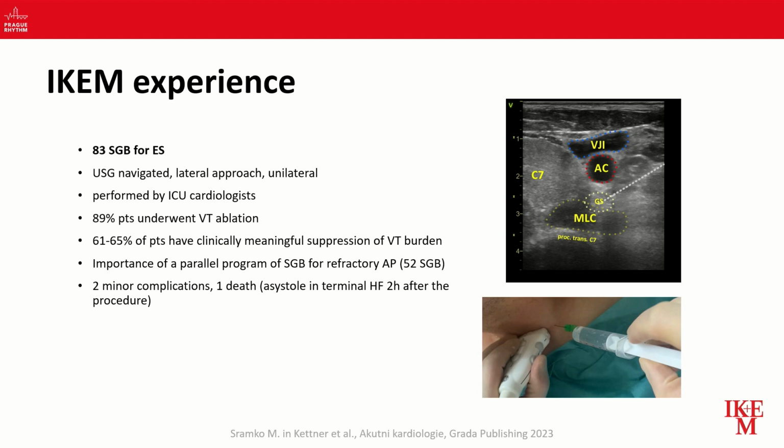So in ICAM, we have so far performed 83 stellate ganglion blockades for electric storms. And it was really a true electric storm with many episodes. We perform the procedure by ultrasound navigation. We use a lateral approach. In most patients, we use only a unilateral approach. Only in a few patients with a failed procedure and continuous VT arrhythmias, we perform also bilateral. It is in our center performed by ICU cardiologists trained in this procedure.